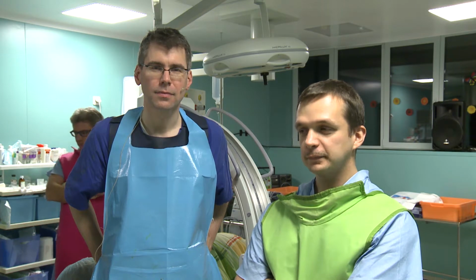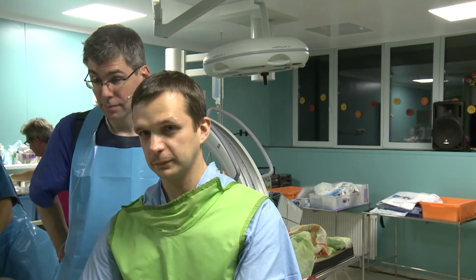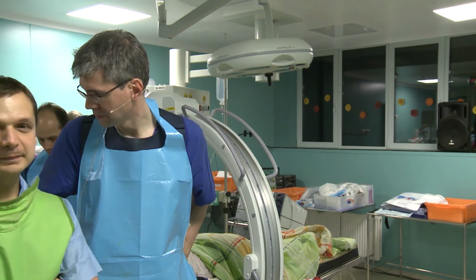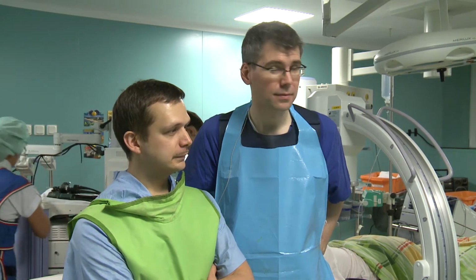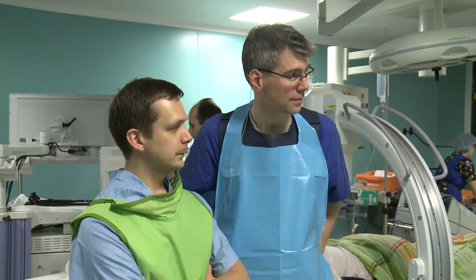But as I said 10 minutes ago, the sensitivity of brush biopsy is quite low, but biopsy is very good. In the first demonstration, when you use a basket to remove the stones, it was much larger. But biopsy forceps were very small, which makes it harder for us to diagnose the disease because the biopsy is very small. But these are standard, conventional biopsy forceps. You will get the same size of biopsies when you take biopsies from the stomach.